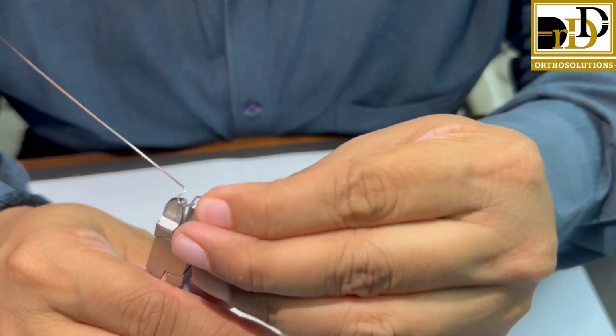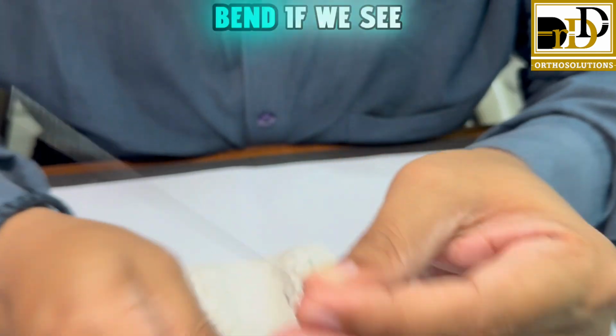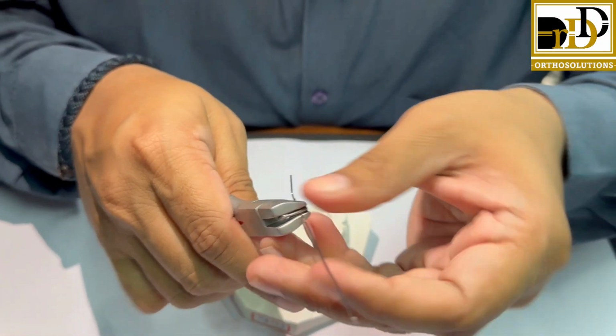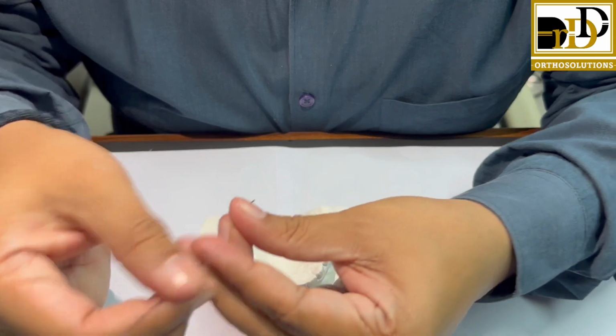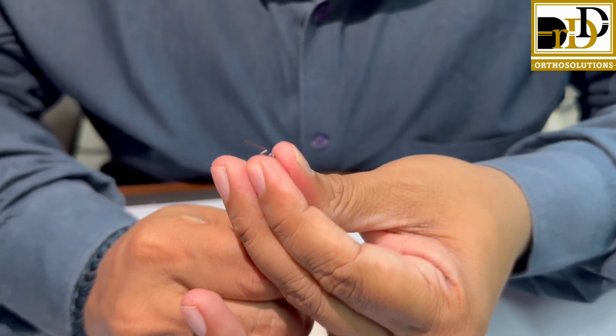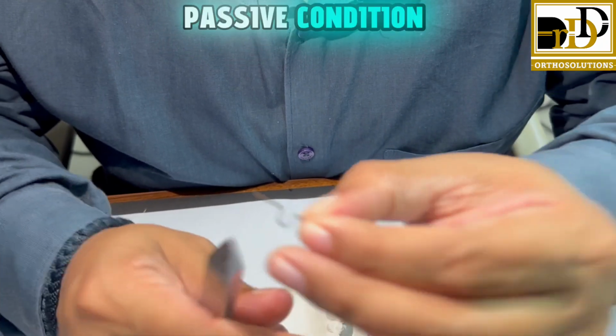So now after giving this bend, if we see, it is in the passive condition.